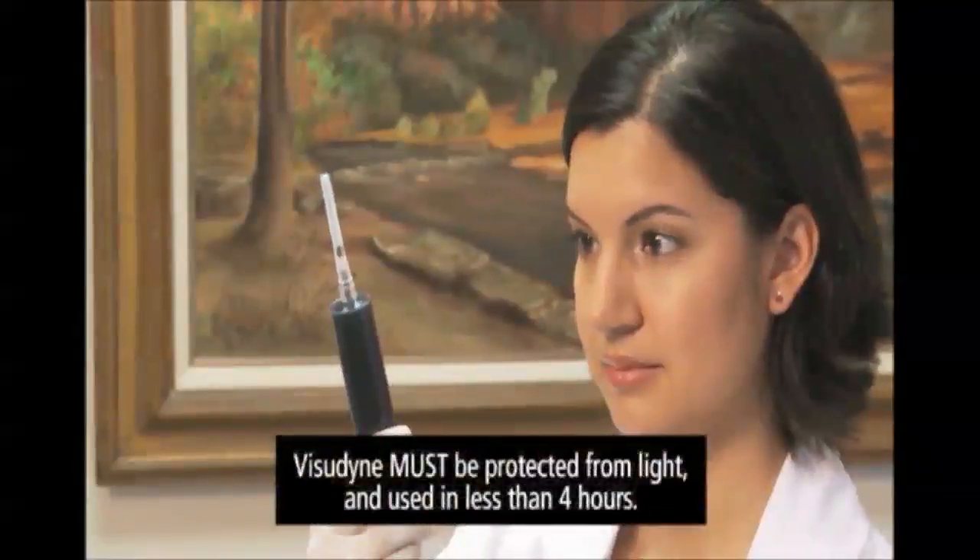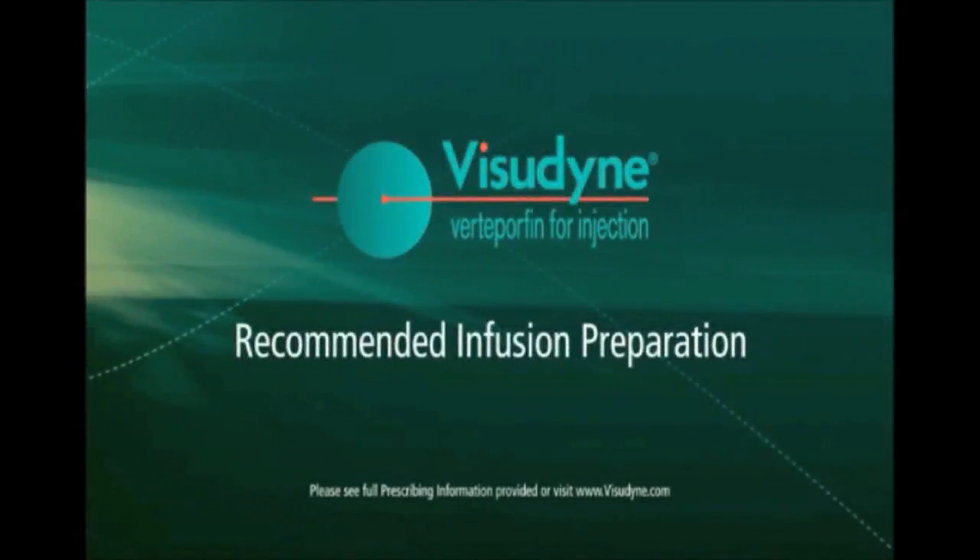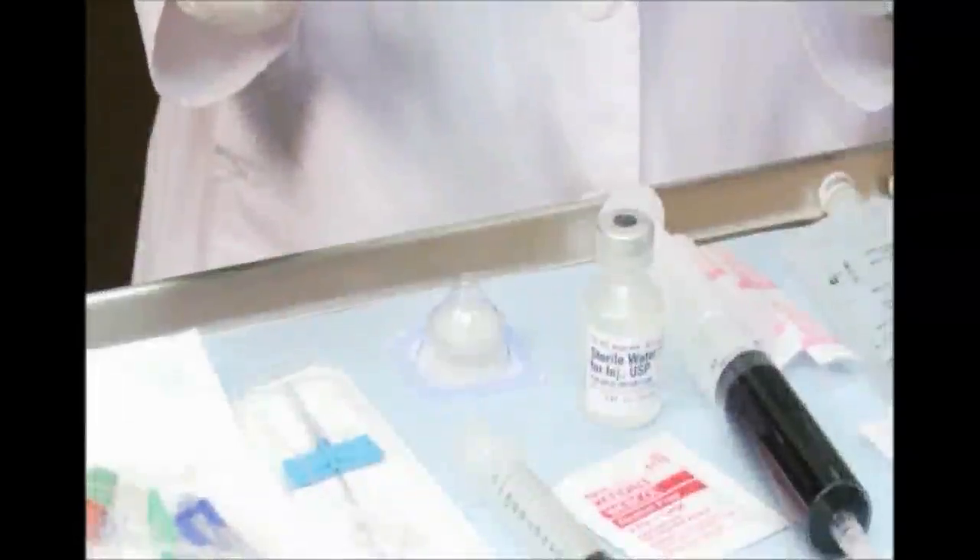Inspect the Visudyne for particulate matter and discoloration. Reconstituted Visudyne must be protected from light and used within four hours. Conduct the infusion preparation according to standard practice using a 1.2 micron sterile filter.